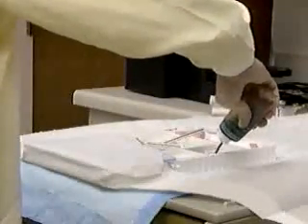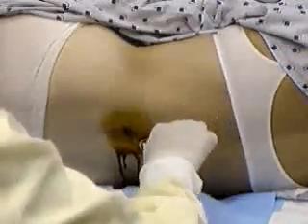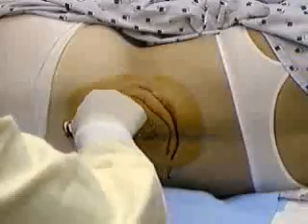After you have put on sterile gloves and unwrapped the fourth layer of covering for the spinal tray, wash your patient's back with betadine. Apply the betadine first at the spot you have chosen to insert the spinal needle. Warn your patient the betadine may feel cold. Paint the area surrounding this spot with progressively larger circles of betadine. Repeat this application two more times. Use firm pressure — the force of friction may help reduce the bacteria count on the skin.